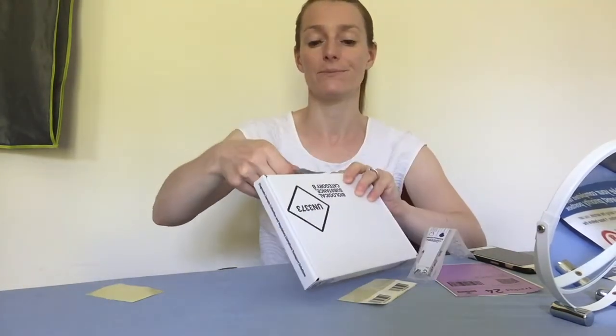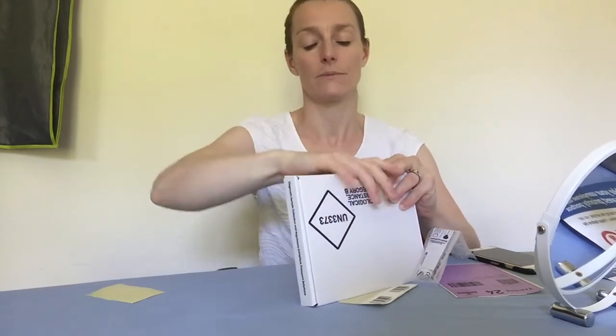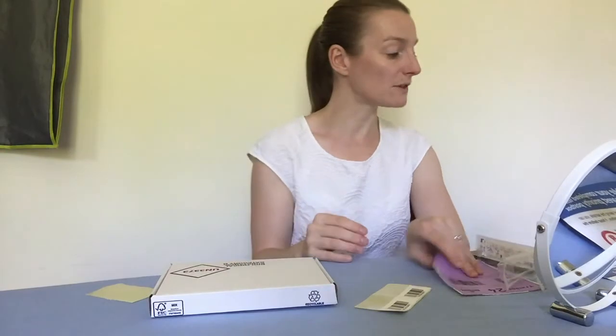Stick the security seal here. When you've done that, the last thing you do is stick your Royal Mail sticker onto the box. If you're having a couriered service, it might look a bit different, but the instructions will be in the pack.